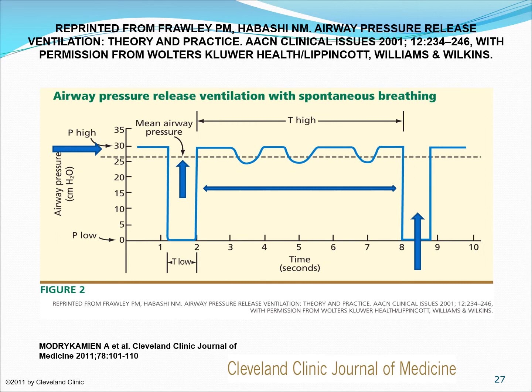The advantage of this system is that the highest pressure you maintain is your plateau pressure, which is this level right here. So your ventilator will never go above that. And the purpose of this long inspiratory time, or your T high, is so that you can recruit collapsed alveoli and allow more time for gas diffusion. I have other pictures, but I just wanted to show you some basics right here.